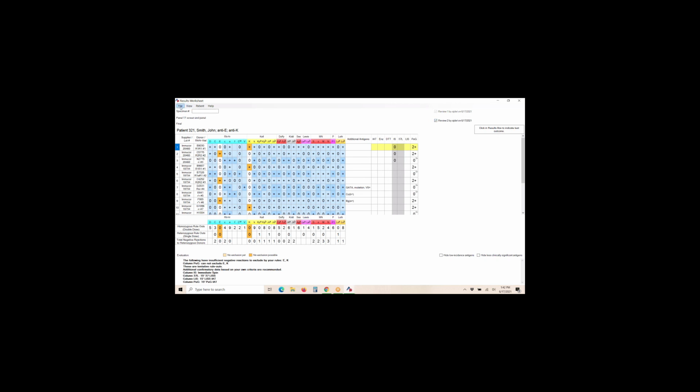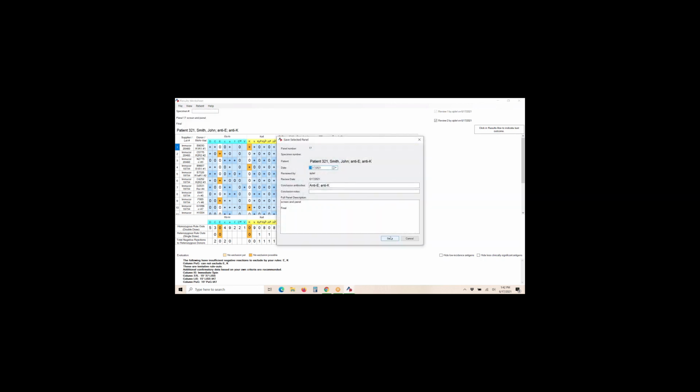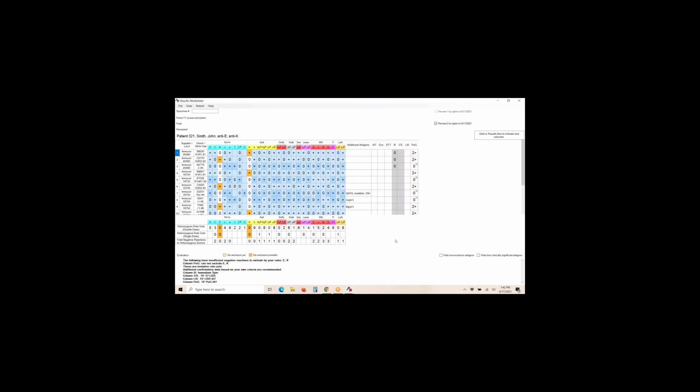The review is not required. It's available if you want it. You don't have to do it. It's something that you can do if you want. And then the reviewer would save their reviewed panel that way. If you want to backtrack everything, you can see who did what. And Alan, I think, was mentioning that earlier about the iterations of the panels. Basically, you can't do anything in Antigen Plus and then pretend it didn't happen. So that's one good thing.